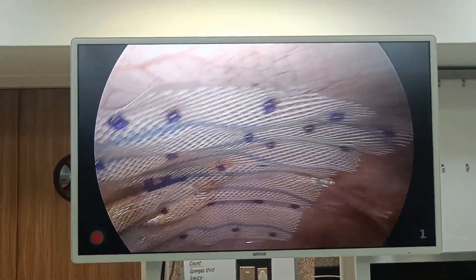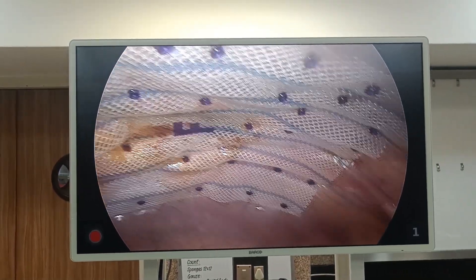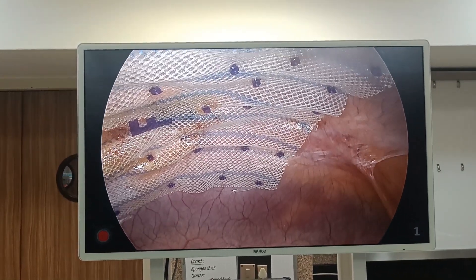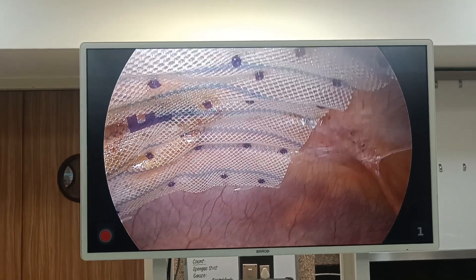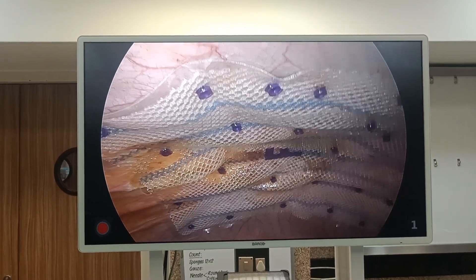This is a case of umbilical hernia where I primarily closed the defect. This is how we place the mesh — this is a dual-tissue separating mesh by Merrill, and you can see how beautifully it is completely flattened and adhered to the abdomen.